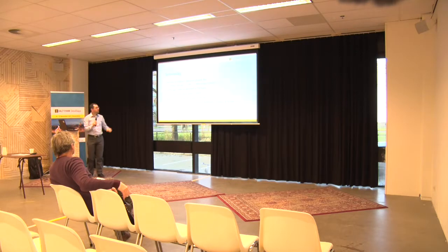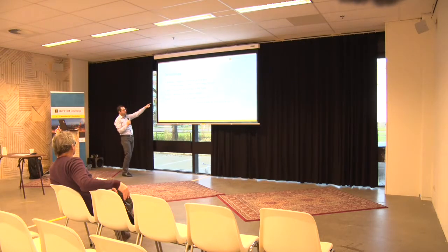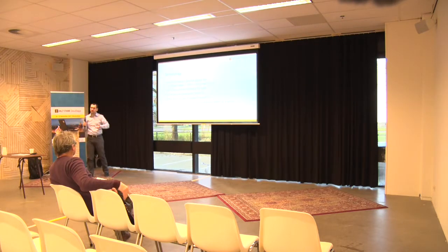More terminology for you. We won't focus too much on this. You don't need to memorize any of this, but basically, you've got to think of DICOM of when this was written, back in the 80s. A lot of things were different. So, for example, if I just jump to the middle, you see it says service class user and service class provider. That's what we today call client and server. That's basically what it is. And then, things like service object pair. If you ever work with DICOM, you'll hear people talk a lot about SOP instance UID, SOP class UID. That's what the SOP is. It's terminology. It doesn't mean anything fancy. It's just stuff that people like to throw around because it's the convention in DICOM.